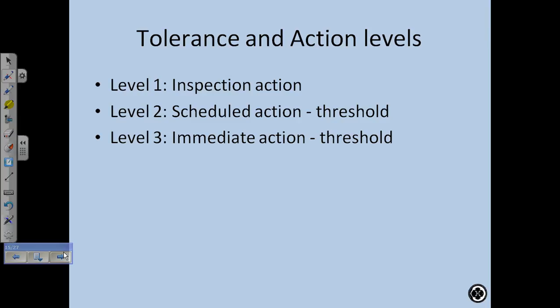And so we know we have tolerance levels. Remember that 3% for the daily QA, that's a tolerance level. 5% is another tolerance level. So there are different tolerance levels. And once we hit the tolerance levels, what do we do at that point? Say our tolerance level for the monthly QA is 2% for outputs, and we get 2.5% measuring output.